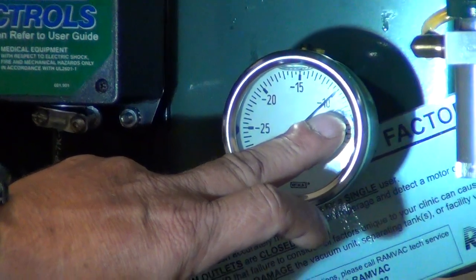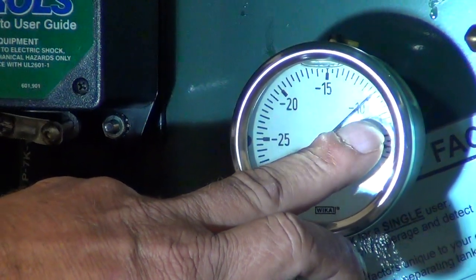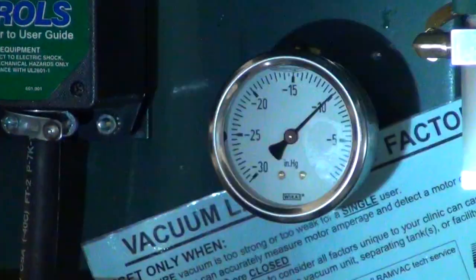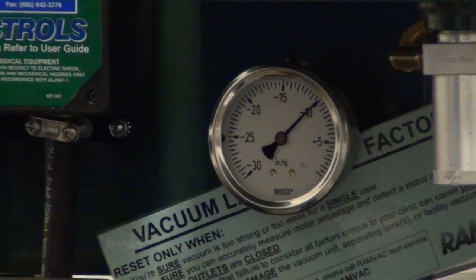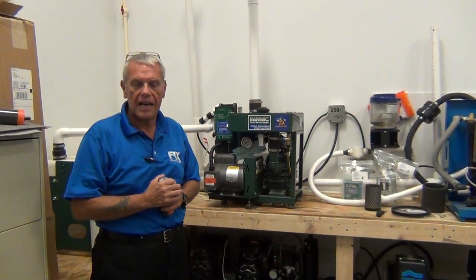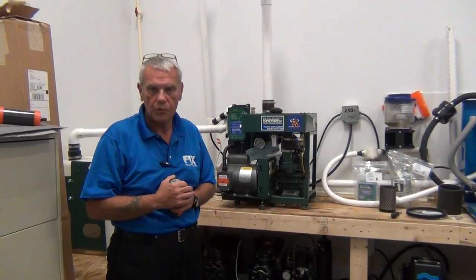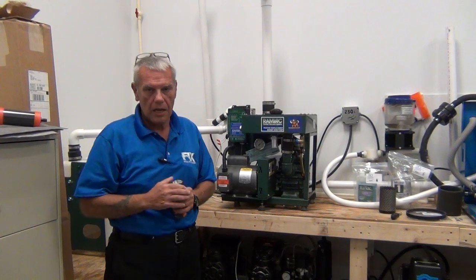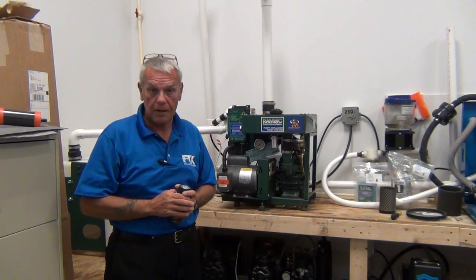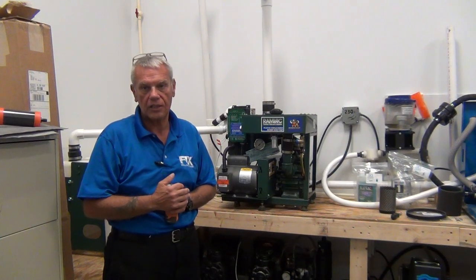Never exceed 12 inches of mercury on this pump. The more you adjust, the more suction, the more amps and load, and the higher the pump strain. If you do need over 12 inches of mercury, it's usually indicative of a problem in the operatories — meaning a leak in the suction line in the operatories or a leak in the plumbing running from the mechanical room to the operatories. Remember, guys, several small leaks in the vacuum system add up to one grand leak, and you will experience loss of suction.